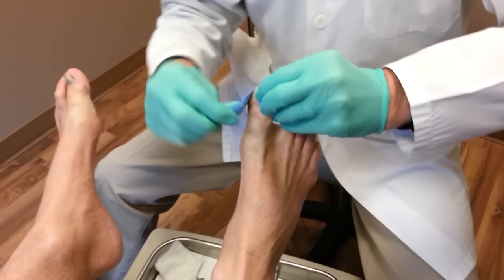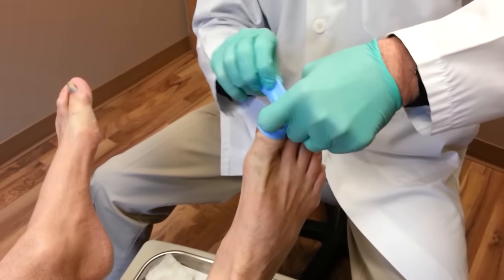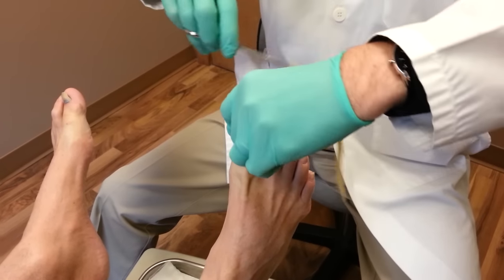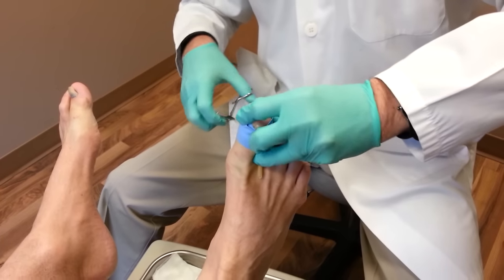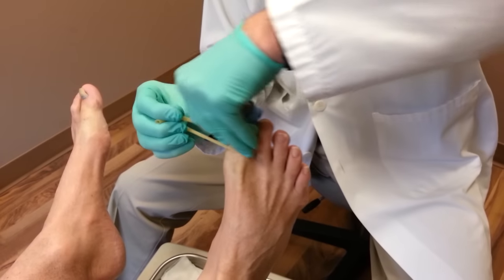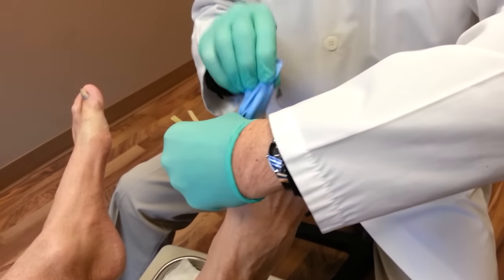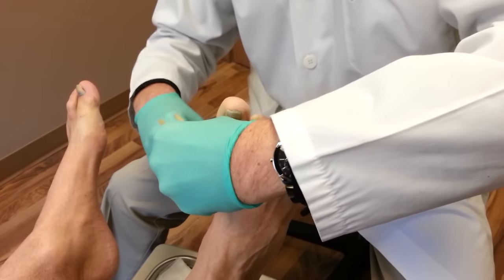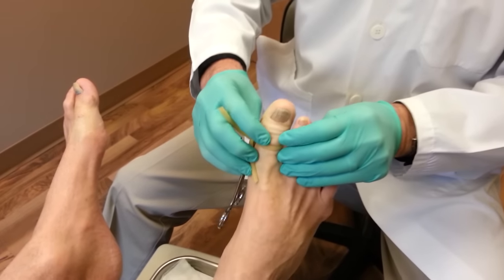So the first thing we're going to do is push all the blood out of the toe. That makes it so there's no bleeding while I'm working, and put a tourniquet around your toe to stop the blood while I'm working. Just relax your foot there.